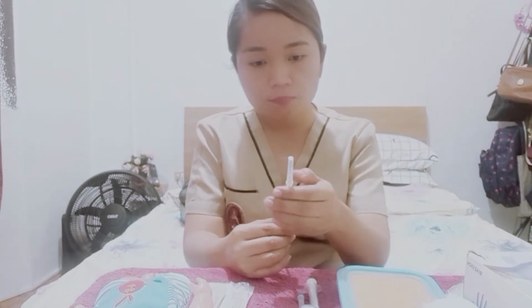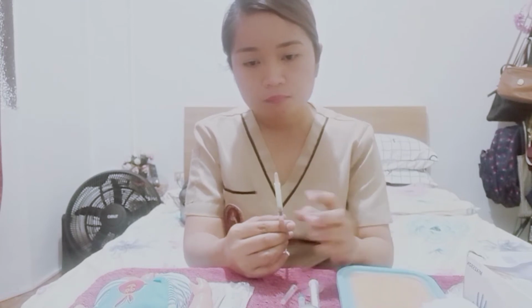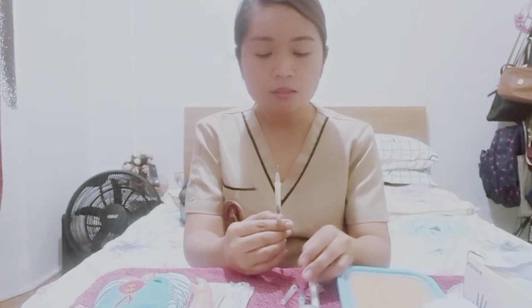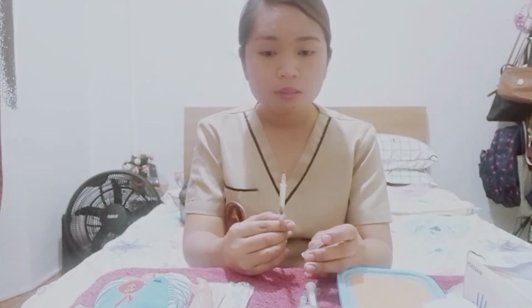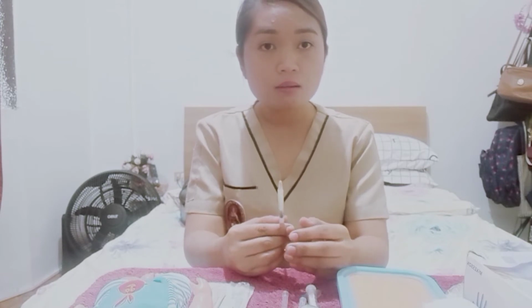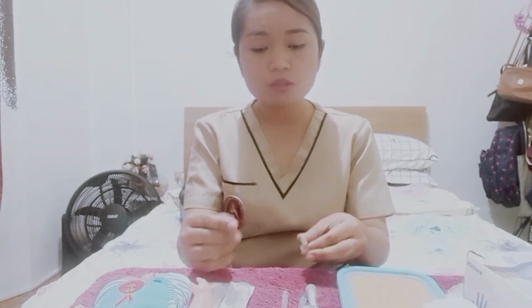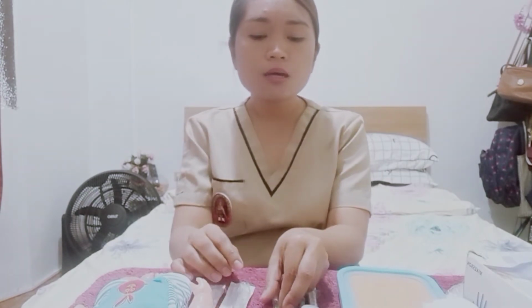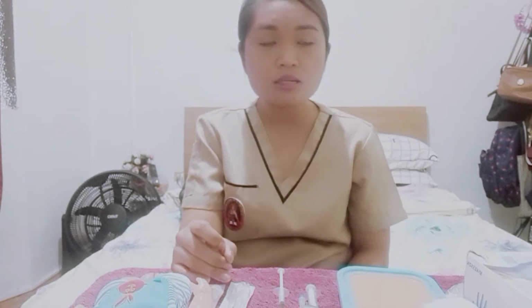Making sure, of course, that we don't prime the needle with the vaccination, to prevent the potential loss of vaccination due to the priming. Okay, so after that, we make sure as well that we don't mix local anesthesia with the vaccination or the medication that we are going to administer.